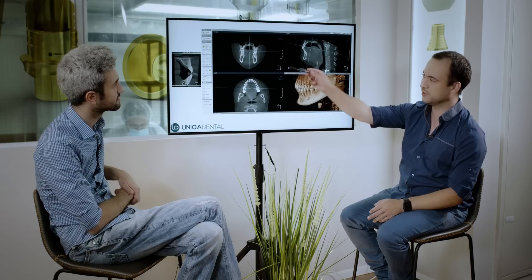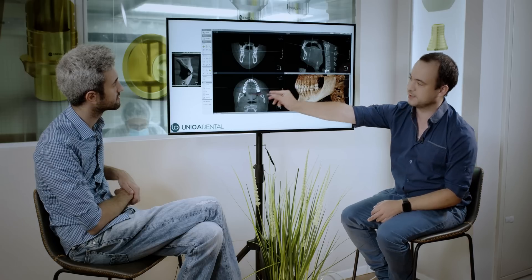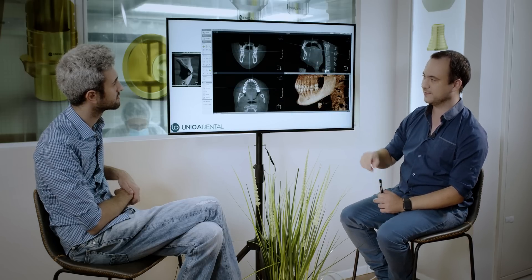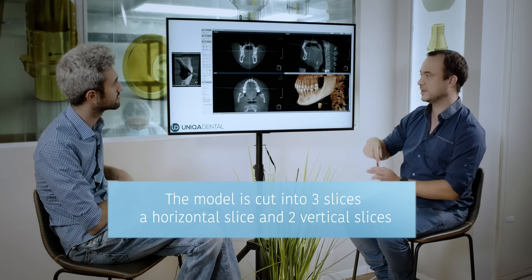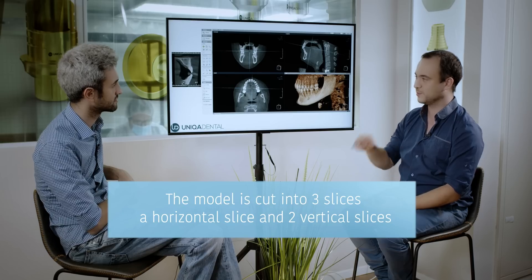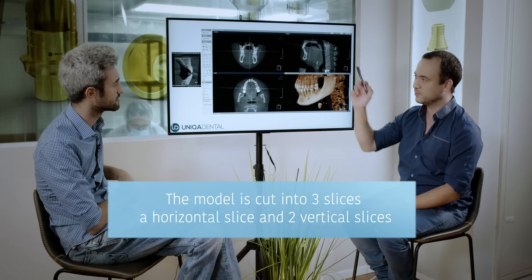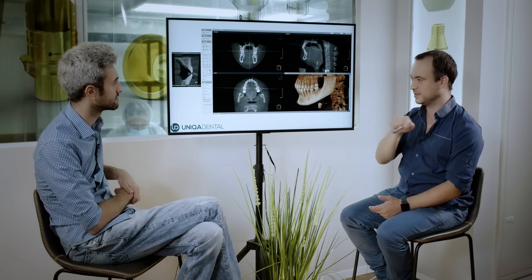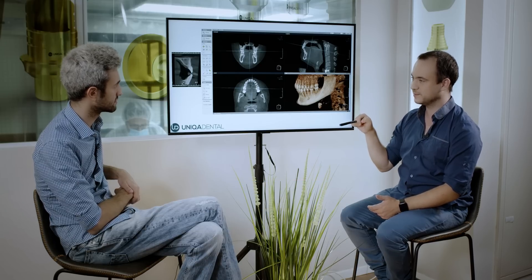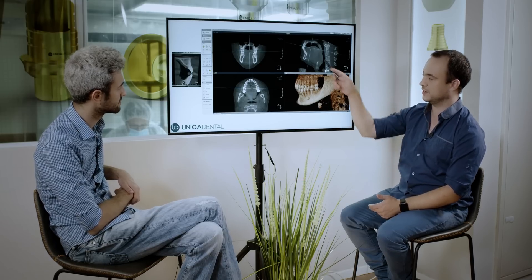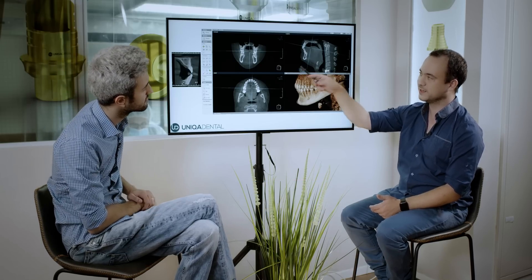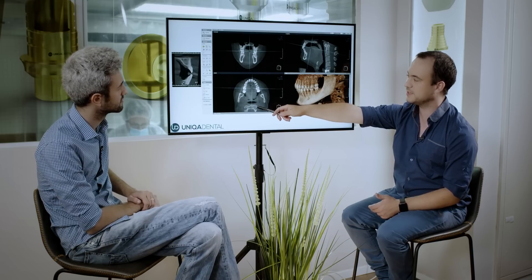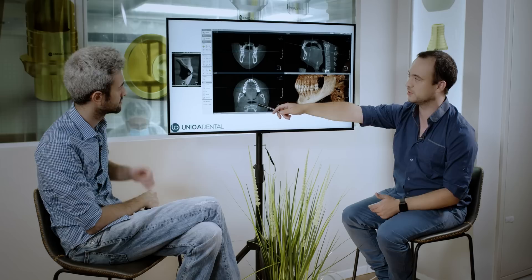I have the horizontal slice, I have a vertical slice, and I have another vertical slice — it's the coronal slice. It's from left to right, from front to back, and the horizontal part. In here you can see the front to back. In here you can see left to right, and this is the horizontal.